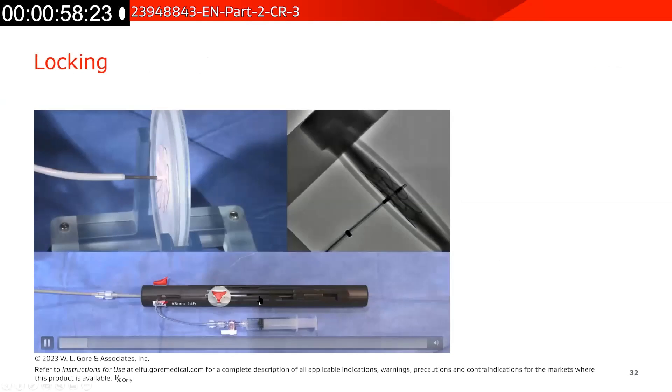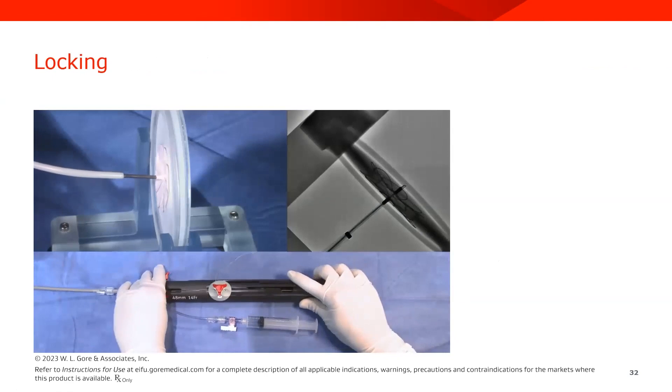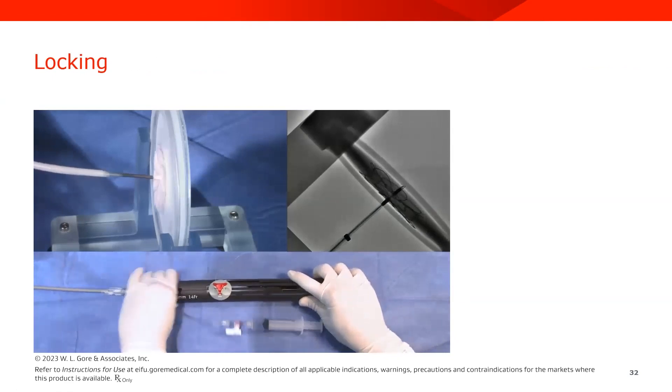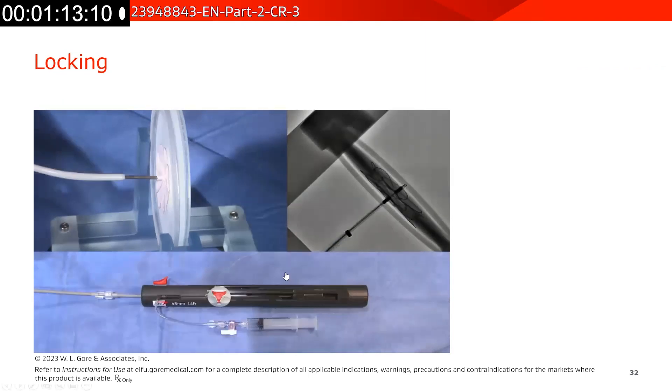To lock the device, you will move the occluder lock to the right. This releases the tension in the device and allows for a tension-free assessment. You will still be attached to the delivery system by the retrieval cord at this point.